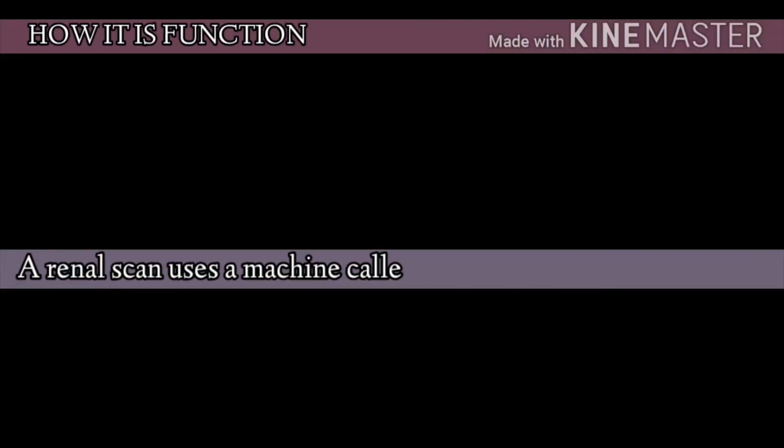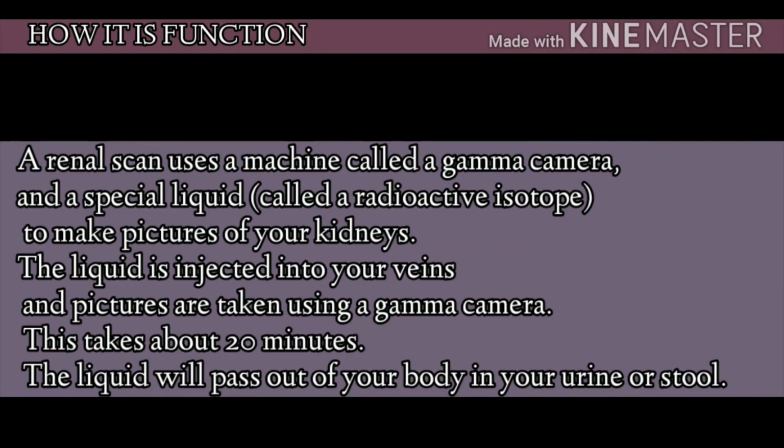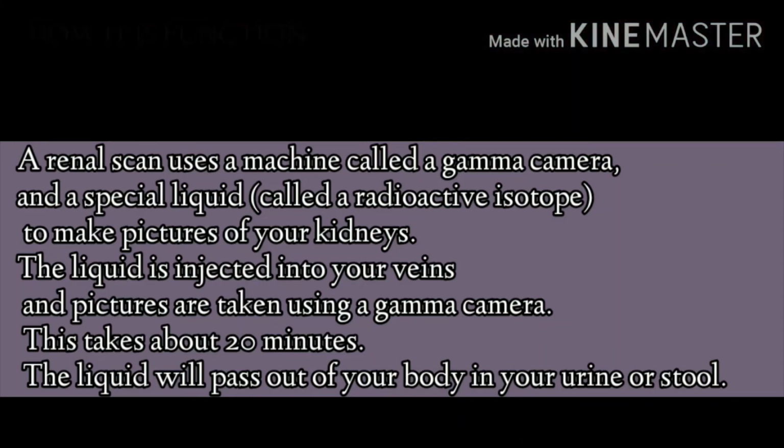How does it function? A renal scan uses a machine called a gamma camera and a special liquid called a radioactive isotope to make pictures of your kidneys. The liquid is injected into your veins and pictures are taken using a gamma camera. This takes about 20 minutes. The liquid will pass out of your body in your urine or stool.